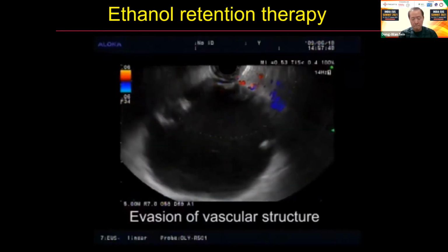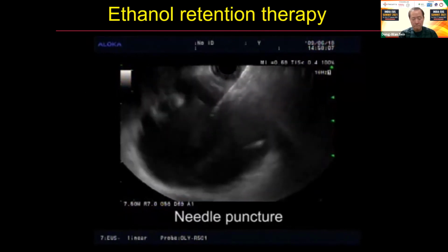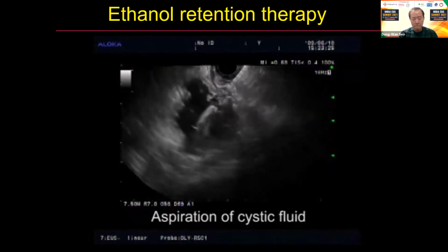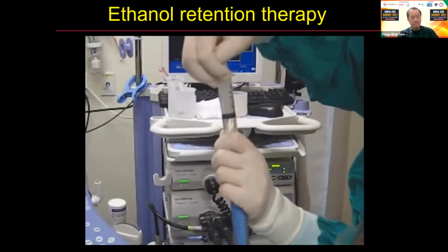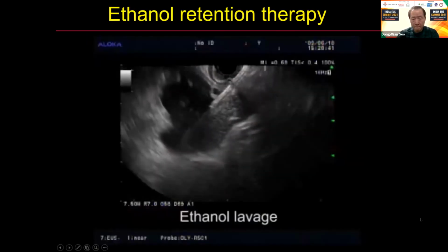Before needle insertion, you generally apply Doppler to avoid any intervening vessel. After needle insertion, we aspirate the cystic fluid, and this is the color of the aspirate. Then we injected 100% pure ethanol inside the cystic cavity. You can see the echogenic jet going inside the cyst.